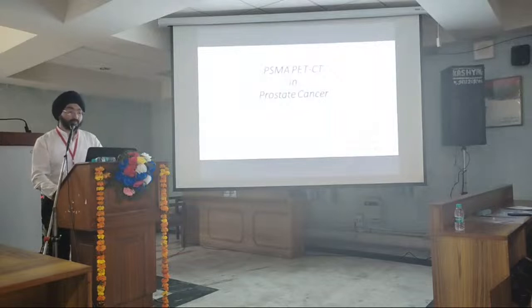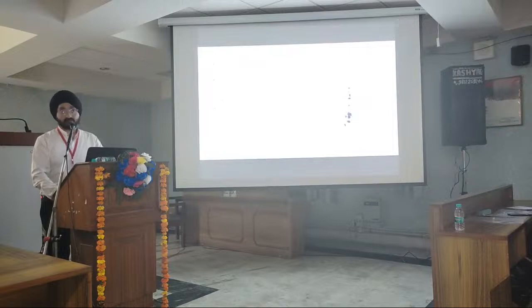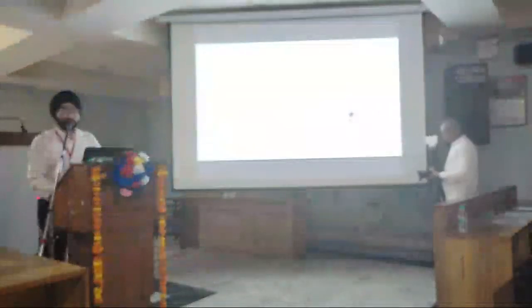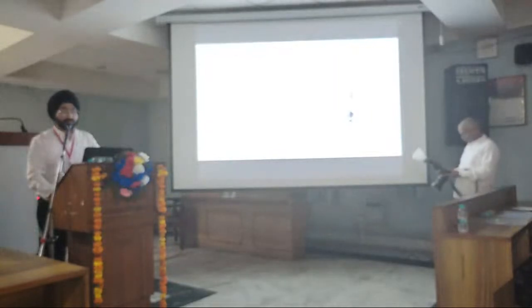I'll be talking about PSMA PET CT in prostate cancer moving forward. Imaging in prostate cancer includes anatomical imaging: transrectal ultrasound, multiparametric MR, and CT, as well as functional imaging, which includes the bone scan, which was the gold standard for detecting skeletal metastasis in prostate cancer, and multiple PET agents targeting different molecular pathways, including lipid metabolism, amino acid metabolism, DNA proliferation, and lately the PSMA PET CT.